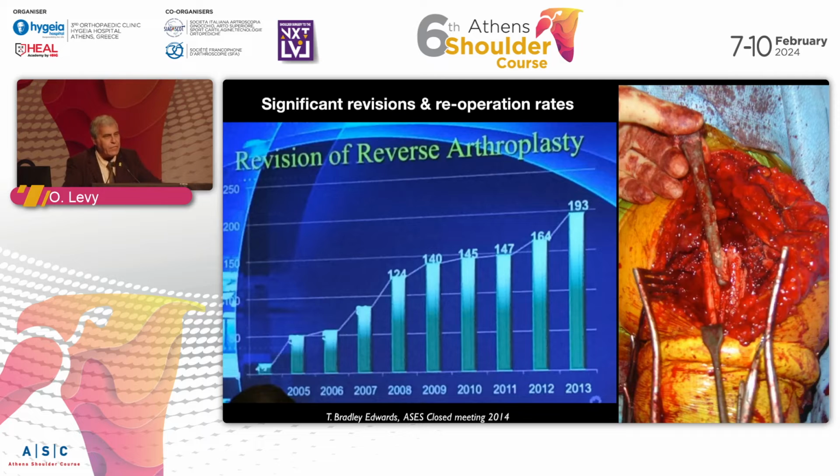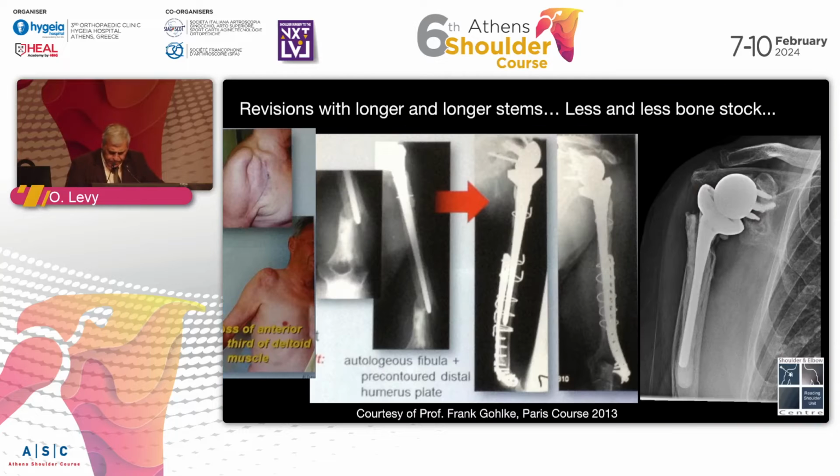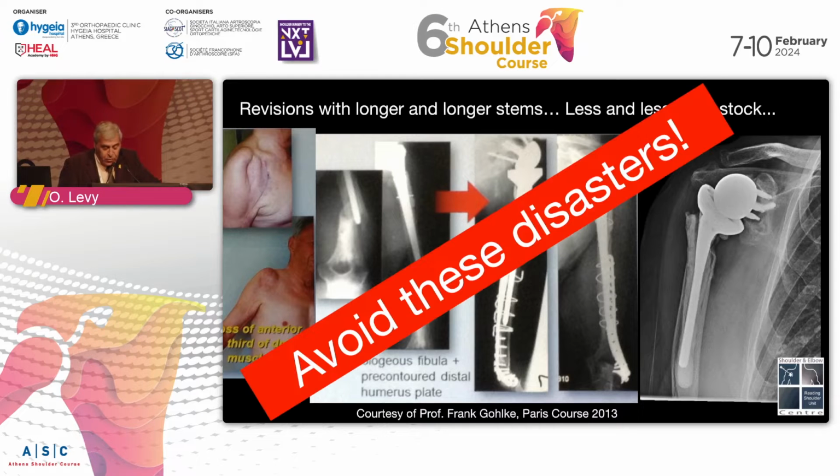And of course, we have revisions. And the more implants go in, the more revisions we'll see. And some of these revisions are very difficult operations and don't really have a good reverse gear. And we see more and more of these revisions with longer and longer stems and less bone stock. And the question is, what's next, what to do? We need to try to avoid these disasters.